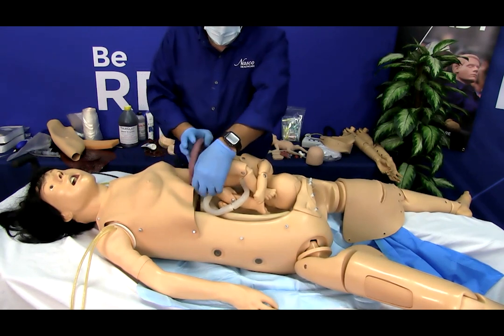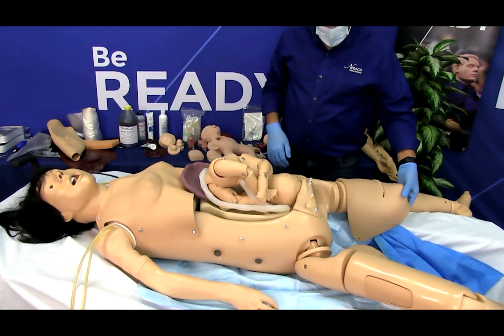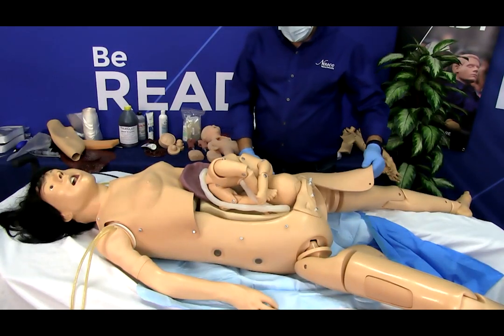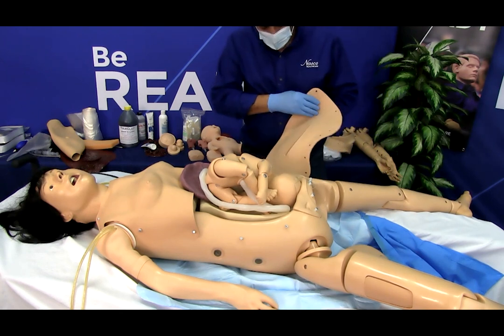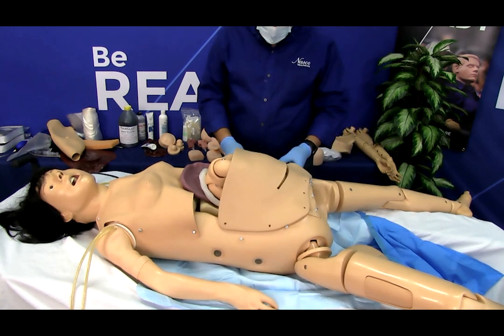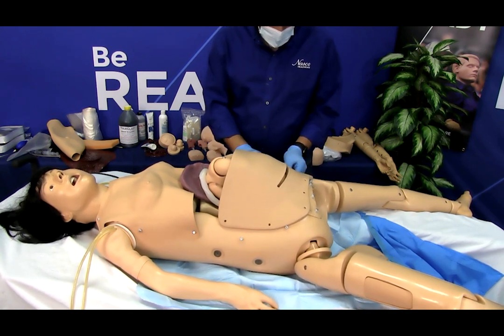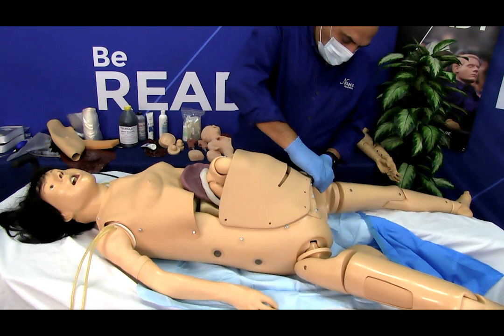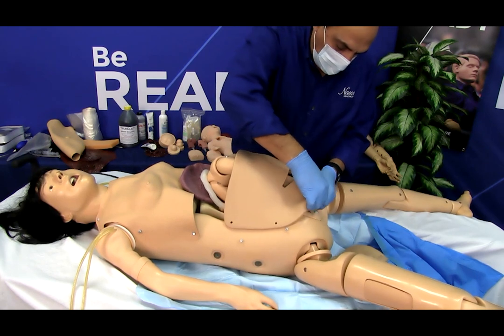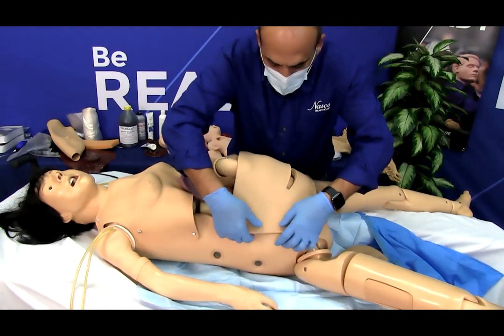The normal abdominal skin may be left off or used with the lower section folded back. Either perineal skin may be used, the prenatal or birthing. Leave the upper section of the selected perineal skin unbuttoned to accommodate the cesarean skin. Install the cesarean abdominal skin on the torso. The preformed incision is specially reinforced and may be closed as desired. Also, please note that repeated suturing and/or stapling will eventually damage the skin and the skin will need to be replaced.